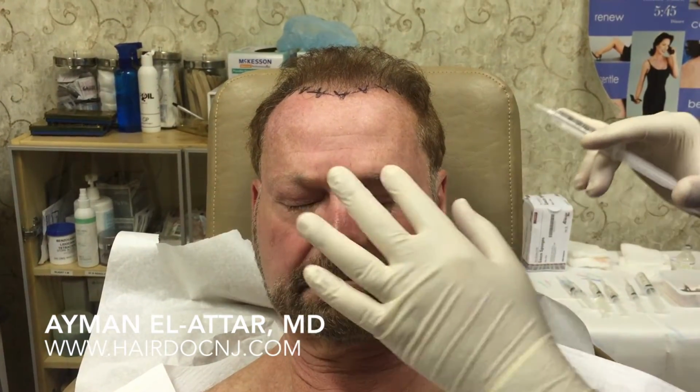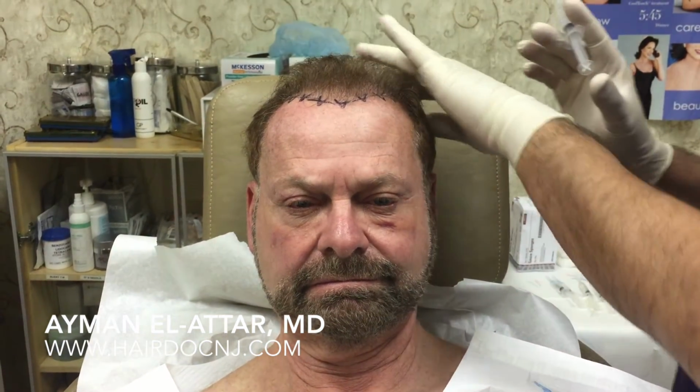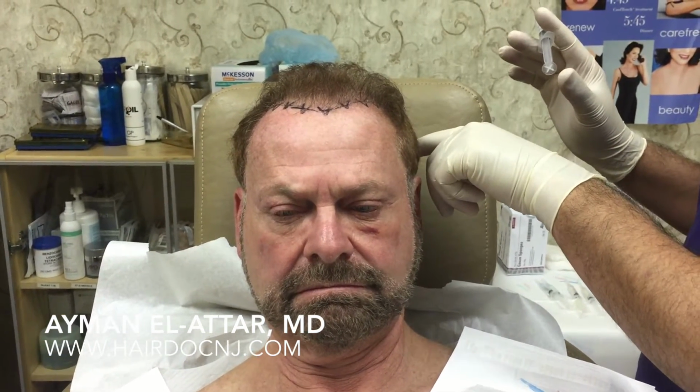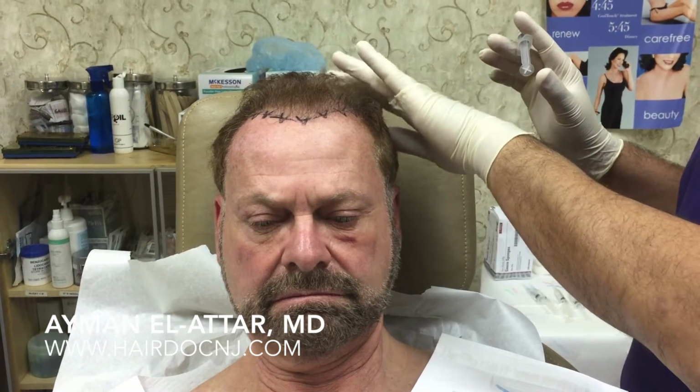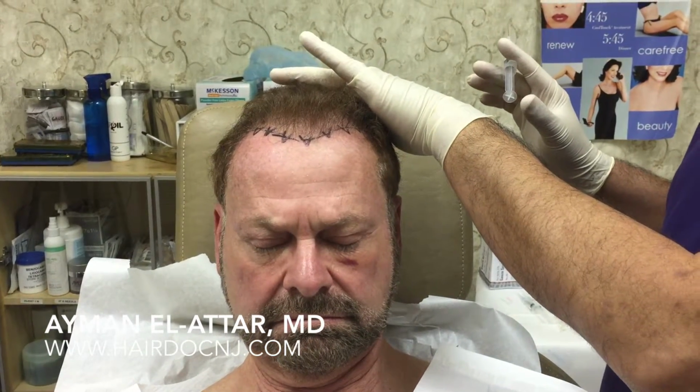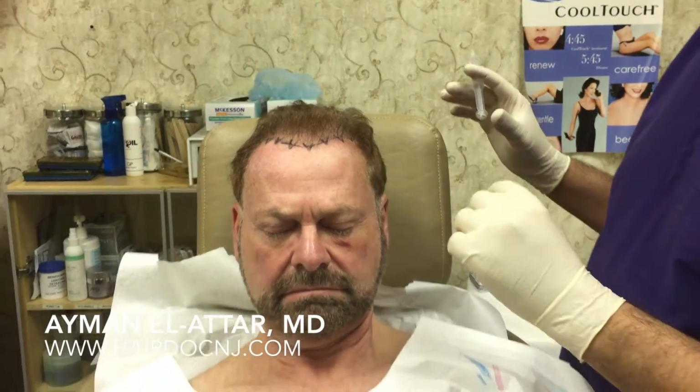Little pressure. How are we doing? That's fine. Okay, perfect. As always. So the posterior area already has been numbed because we took the strip, and that kind of numbs the branches from the occipital nerve, or the posterior branch of the occipital nerve.